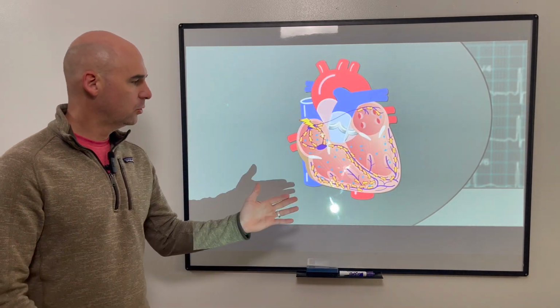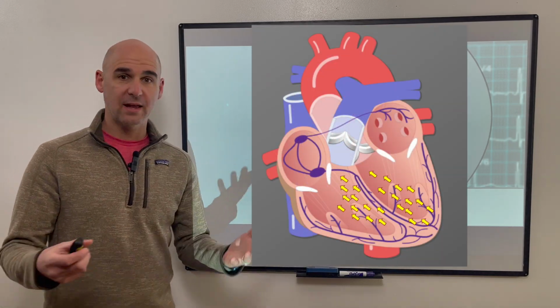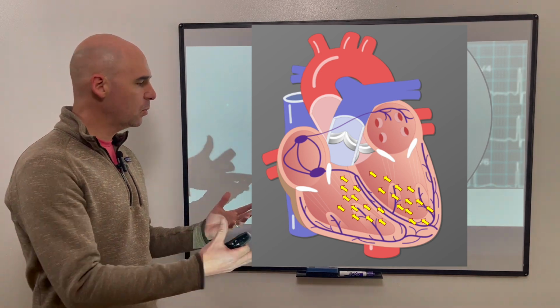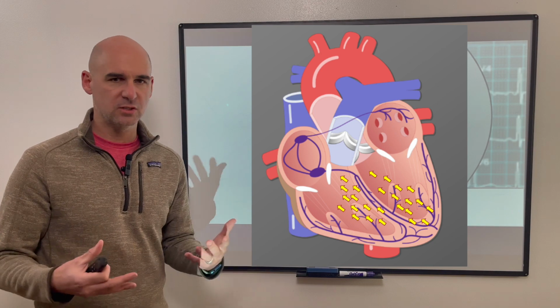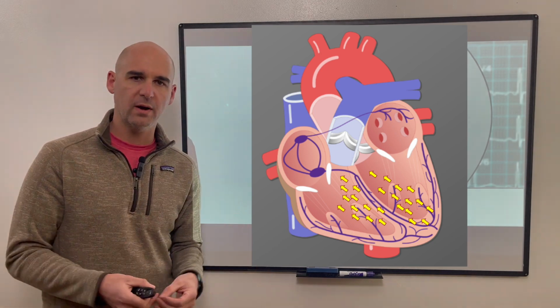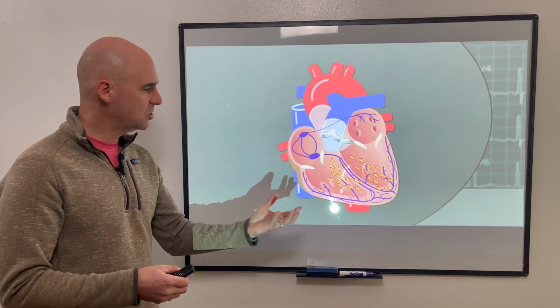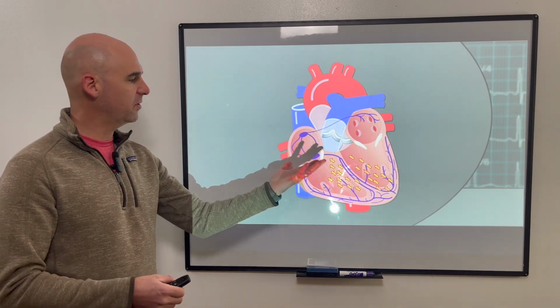So again, normal axis for normal conduction versus when this depolarization happens in the ventricles. And you can see that somewhere in the ventricles, and that spot can change. Just depends, not one particular spot, depends on where in the ventricles that spark happens. But when it does, you can see this depolarization wave is going to move from the ventricles and moving backwards.